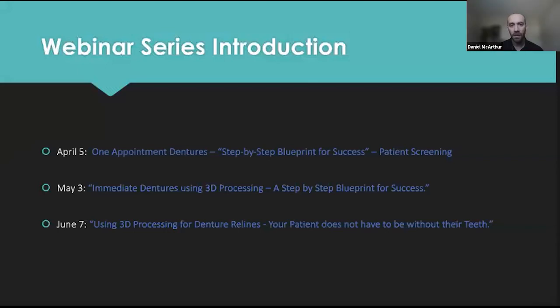Perfect. So we have another one. Do you have to remove AI when scanning the dentures outside the mouth with iTero? Yes, so important. Pretty much anytime I do a denture scan in any capacity, partials, immediates, completes, I disable AI cleanup.